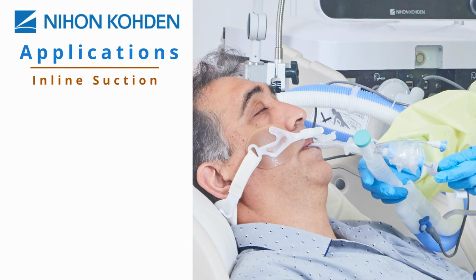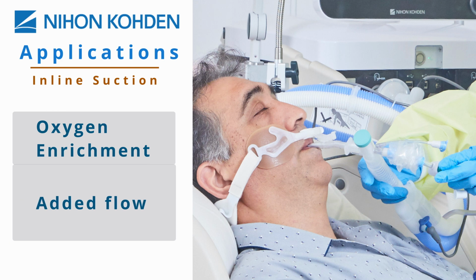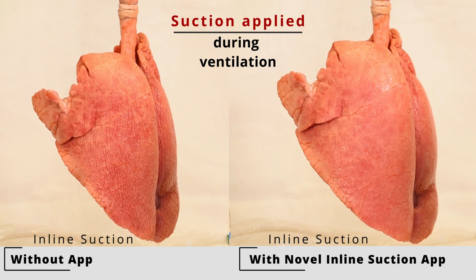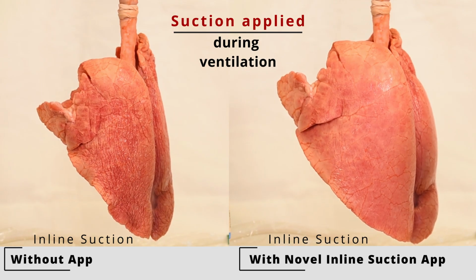The Inline Suction App not only provides customizable O2 enrichment, but also provides additional flow to compensate for the negative pressure generated in the lungs during suctioning. The brief demonstration showcases how dramatically open lung units can collapse from a typical inline suctioning maneuver, and how the novel Inline Suction App can help mitigate derecruitment of the alveoli.